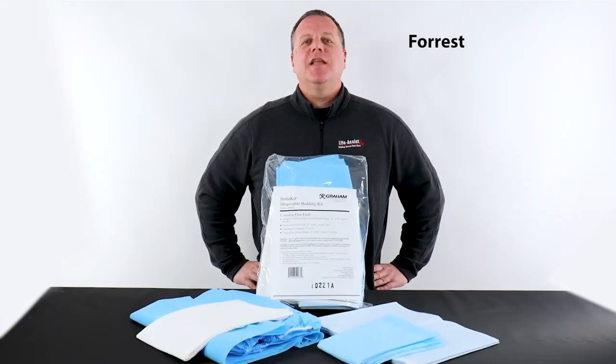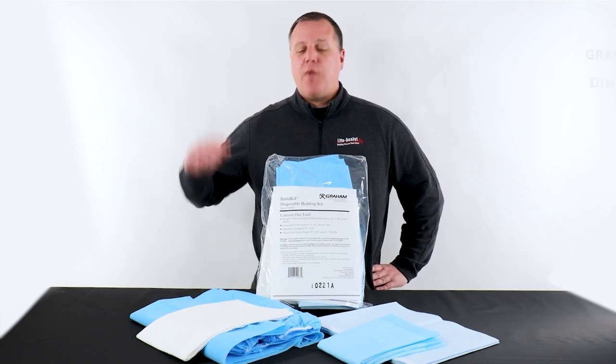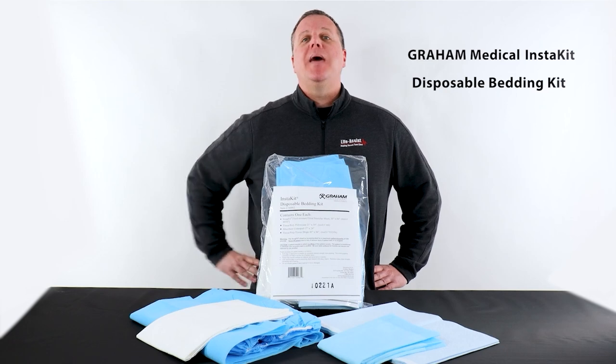Hey everybody, I'm Forrest, Life Assist Senior Product Specialist and former Paramedic, and today we're taking a look at the Graham Medical Instakit Disposable Bedding Kit.